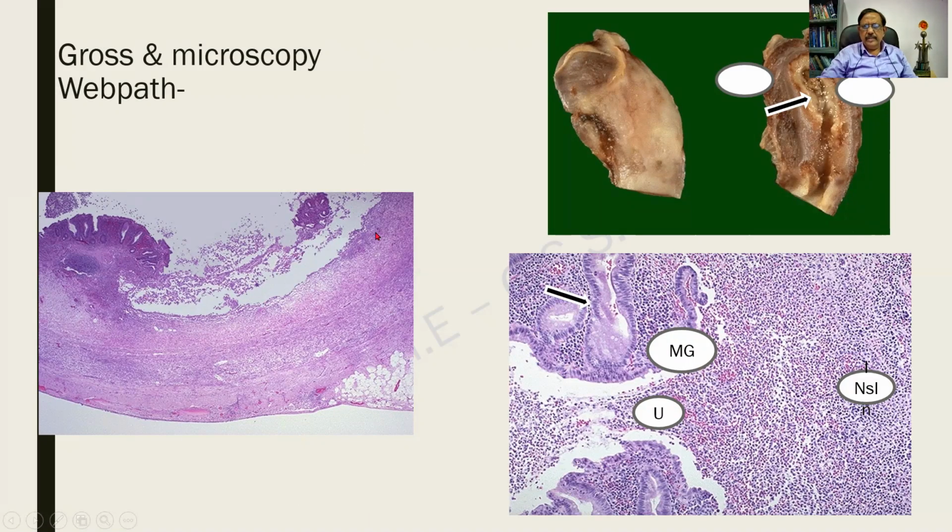And this structure shows a large area, an extensive area of ulceration. This is an important diagram. In fact, this will be kept in the slide for you, exactly focused. I am finding the mucosa. These are the mucus glands with goblet cells. There is an area of ulcer where I am not seeing the mucosa at all. Area of ulceration.